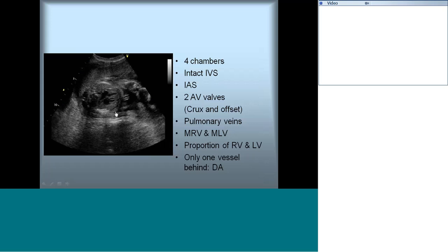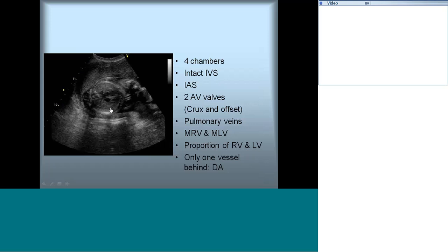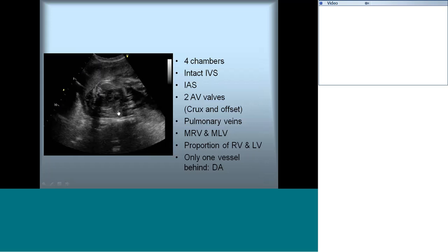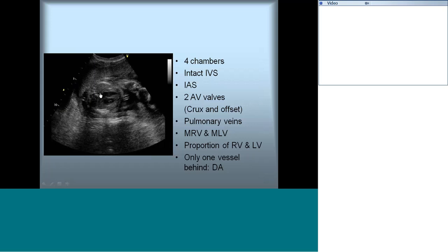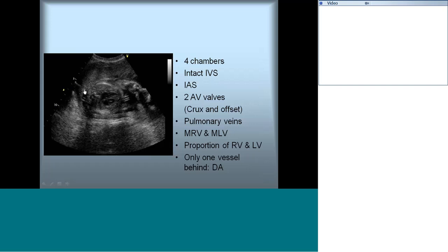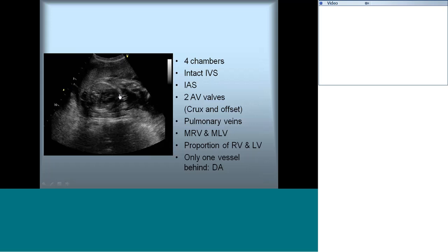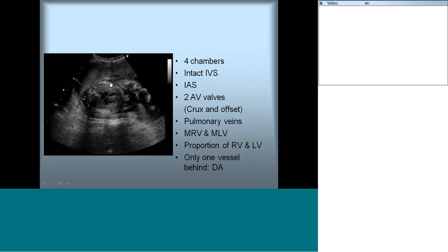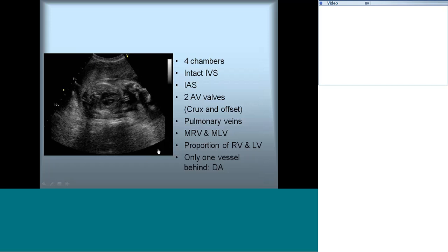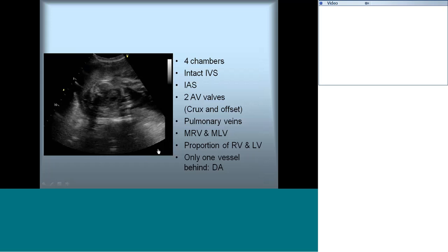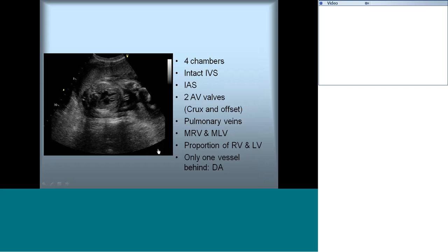There should be a single vessel behind the heart — the descending aorta — visible in this view. Make sure the descending aorta, apex, and stomach bubble are all on the same side. This gives you an idea about the visceral situs, atrial situs, and the gross anatomy of the heart.